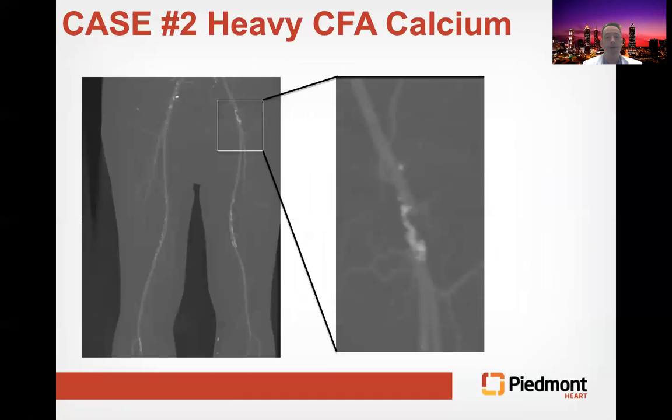50. We got a preoperative CT angiogram, with heavy calcification noted, all involving his common femoral. Doesn't look like he had much of a lumen there. But what we could see was that it was heavily calcified. We knew this was going to be a challenge.